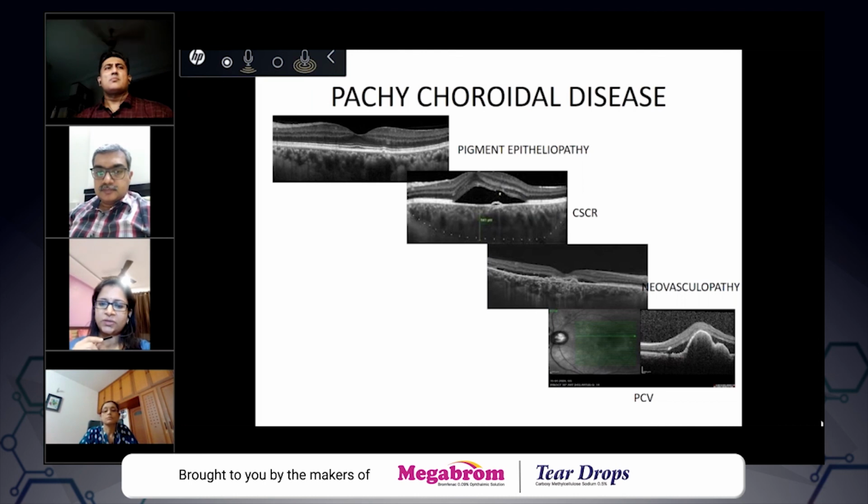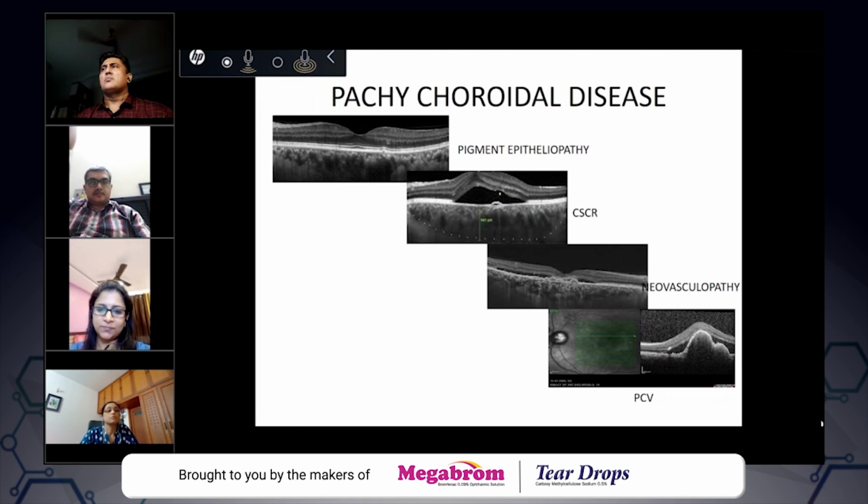Okay, sir, I would like to ask you, when there is a new fresh case of an active CNVM, how would you like to proceed? Do you do FFA and OCT both, or what is the protocol followed? Generally, when the patient comes, we will do an OCT so that we will get an idea. And then, of course, we will definitely do an angiogram in these cases.